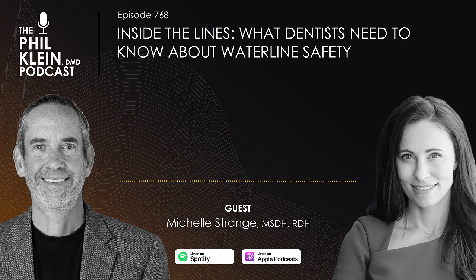Right. The basic difference is how you treat the water, whether it's a cartridge straw system or just tablets added to water. But both of those systems have tubing in them that draws the water out into your system. In the cartridge straw system, the straw is the tube. In the simpler system, before the cartridge straw system came out, you just drop tablets into a water bottle, and the tube in there pulls that water out into your chair.